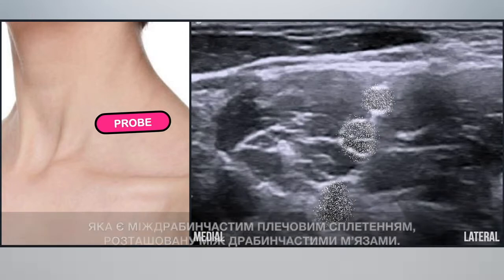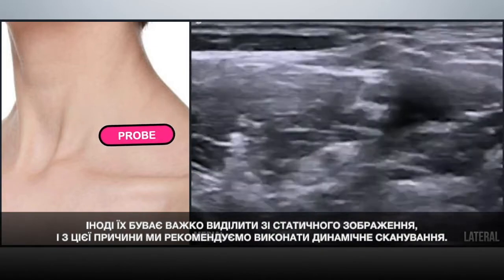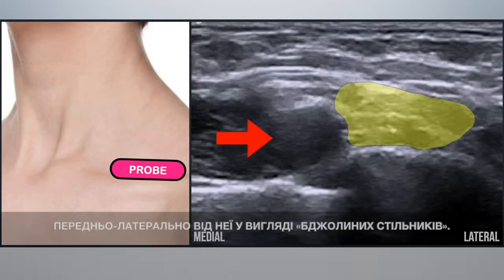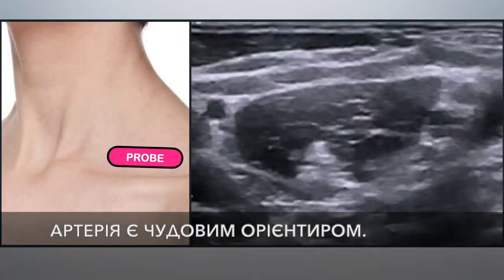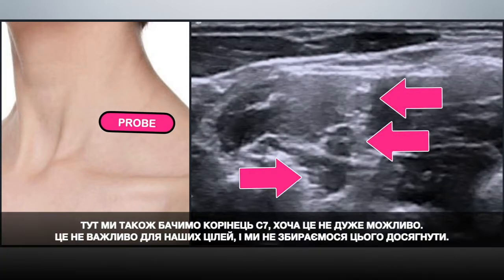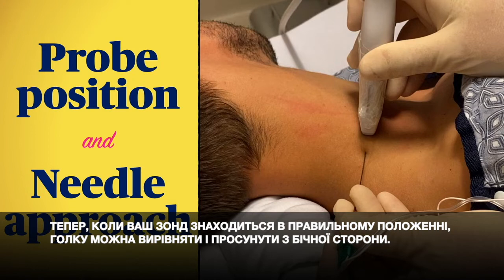Sometimes these roots can be hard to pick out of a static image, so we recommend doing some dynamic scanning. Slide the transducer down to the clavicle until you see the subclavian artery and the honeycomb of plexus anterolateral to it — the artery makes a great landmark. Then it's an easier job to scan up the plexus until you see the C5 and C6 roots distinctly. We see the C7 root here too, although you may not always; it's not important for our purposes and we're not going to target it.